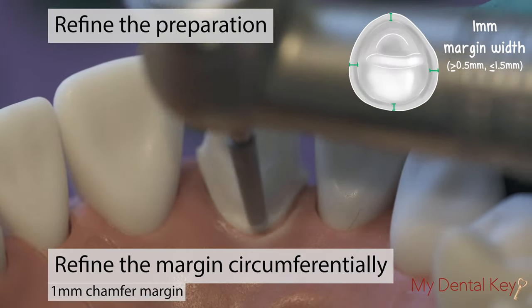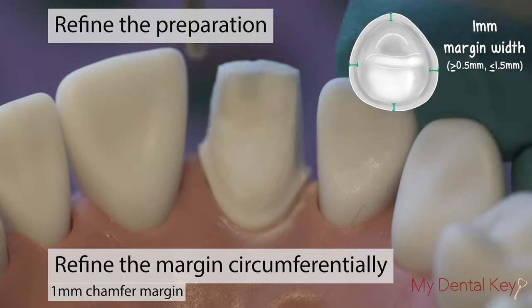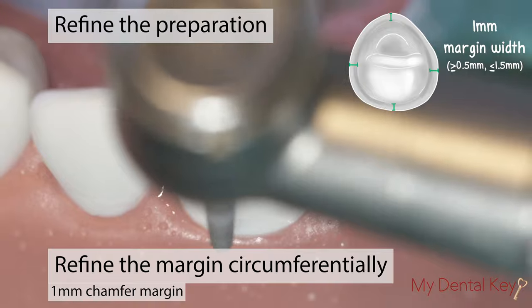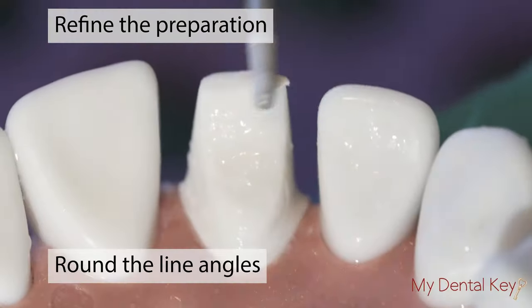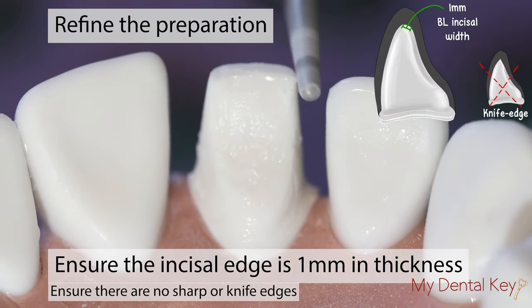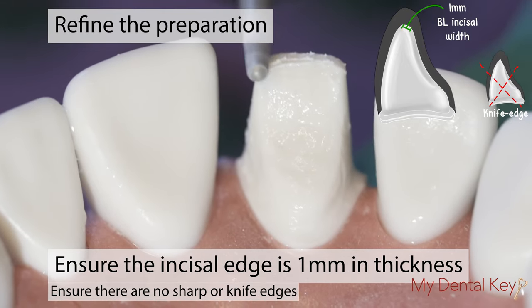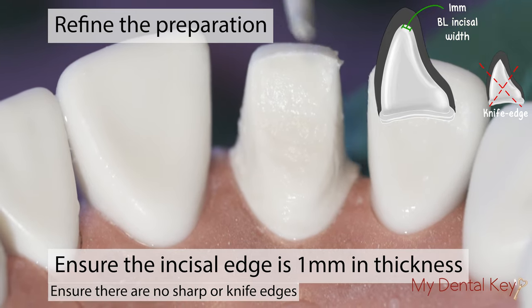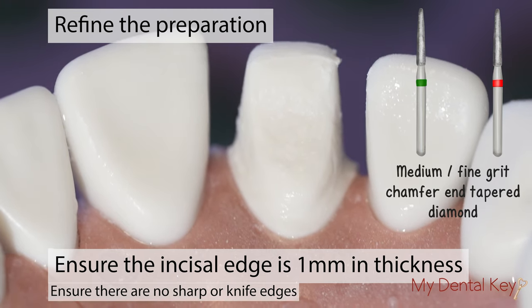Now it's time to refine and smooth the crown preparation. Refine the chamfer margin so that it is uniformly 1 millimeter wide circumferentially and approximately 0.5 millimeters supragingival in height. Round all of the line angles of the preparation and ensure that the incisal edge is of adequate thickness, approximately 1 millimeter. In other words, avoid knife edge or sharp incisal edges. For this step, burr options include medium to fine grit finishing diamond burrs with a chamfer end.